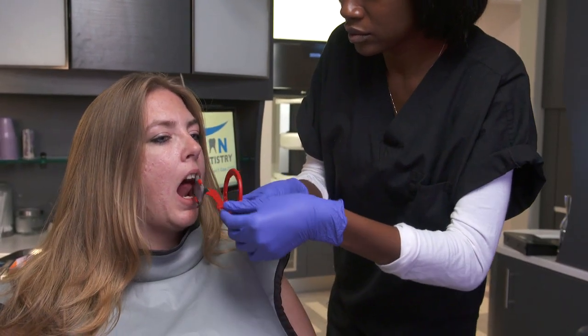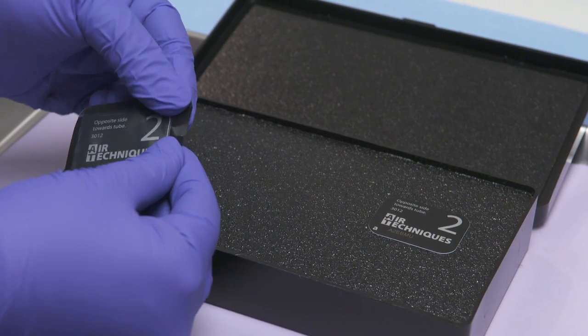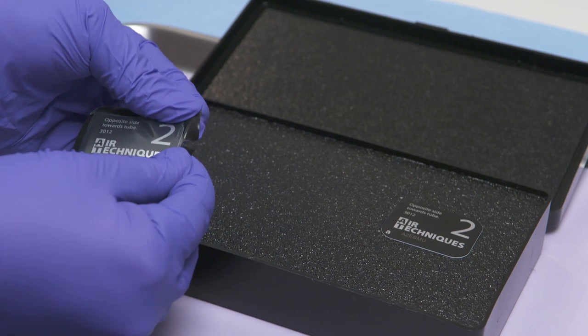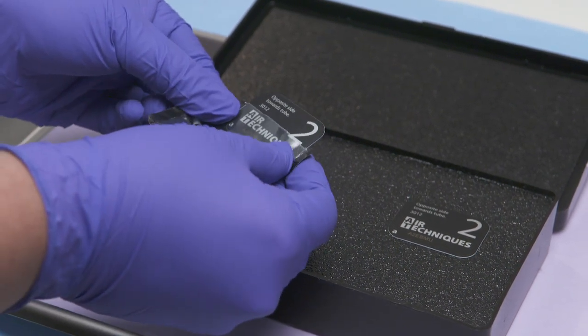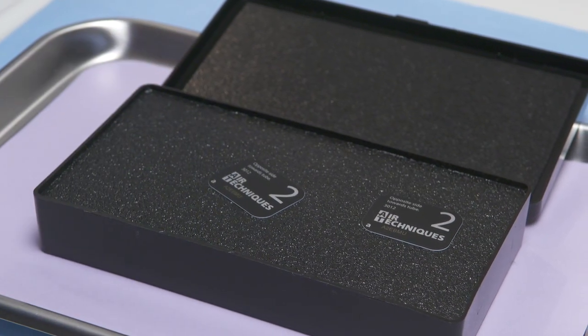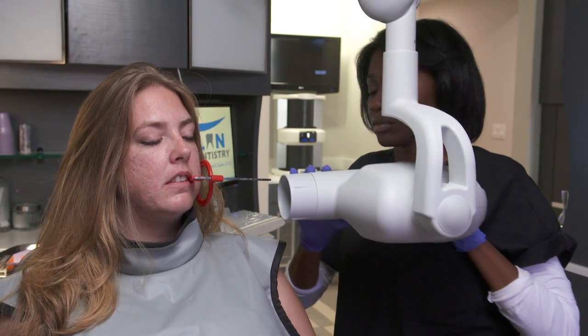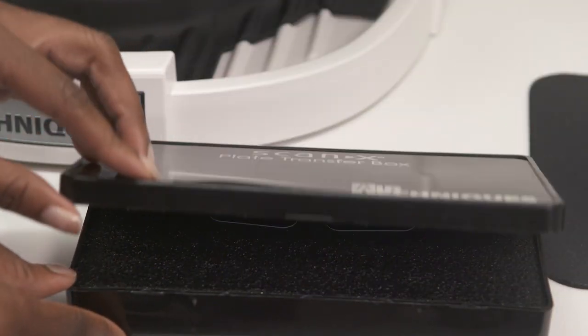Once the image has been exposed, remove the envelope from the patient's mouth. Tear the envelope lengthwise starting at the notch and gently let the sensor drop into the open transfer box, printed side up. Be sure not to touch the sensor or the box with your gloved hand. Repeat this process if you need to take more x-rays. Remove your gloves and close the transfer box.